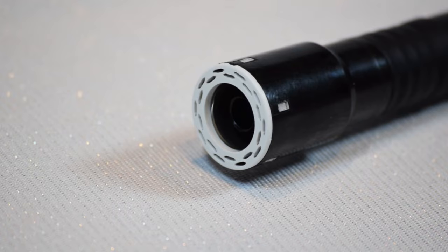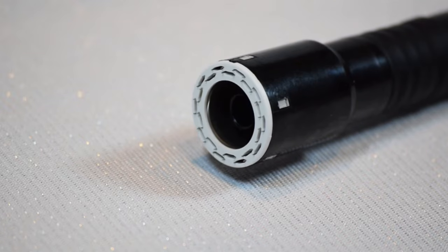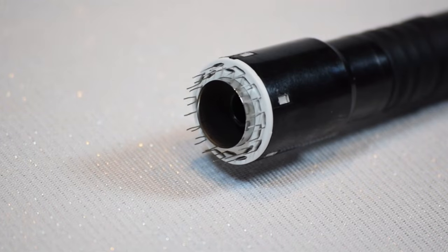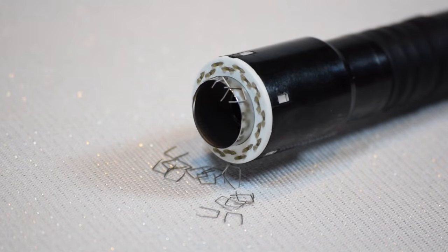Here is the head of the stapler, and you can see these holes where the staples come out, and hidden inside is the cylindrical knife blade that's going to come out and cut the tissue. Now I'm going to fire this, and without the anvil attached, again, the staples are going to fly out everywhere, but you're going to see how they come out and how the knife blade follows right behind them to cut the tissue.